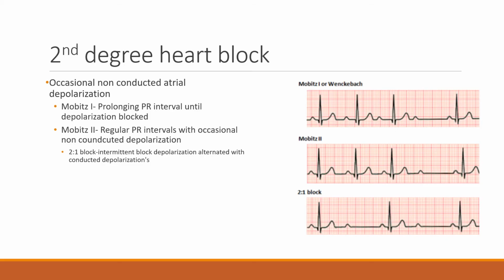A Mobitz 2 is when we have a regular PR interval, but we simply drop a beat right here, but resume with a regular PR interval. Either way, both of these are types of second-degree heart block.